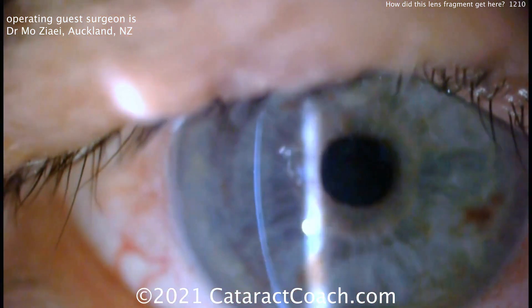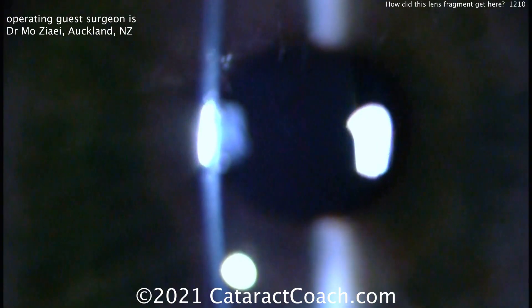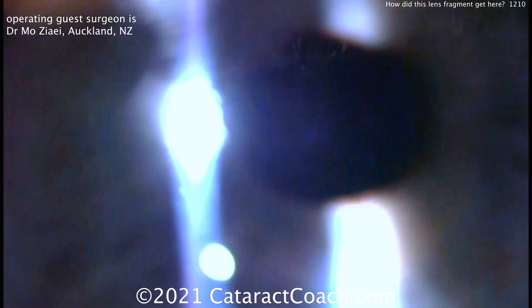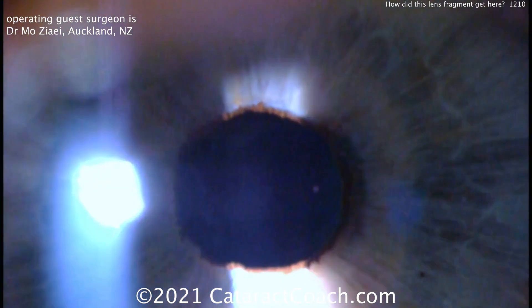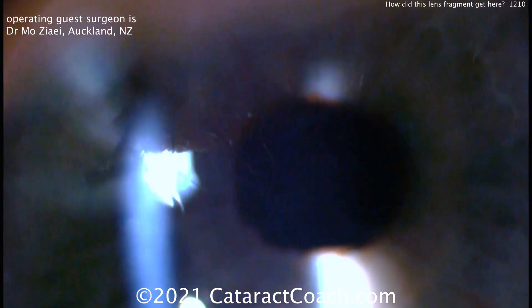But should you? No. Leave it alone. Look what happens here. In the post-op period, that tends to fall out of the visual axis, and it'll dissolve slowly or be absorbed with inflammation over time. So don't be a hero here — leave it alone. Learn from Dr. Mo here. Look at that — a beautiful result. The patient had fantastic vision afterwards and no complications, maybe just a little extra inflammation.